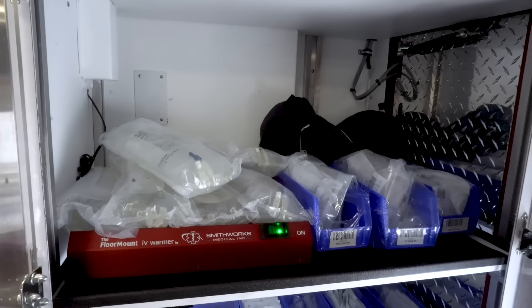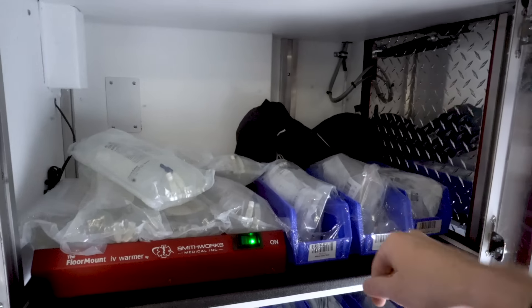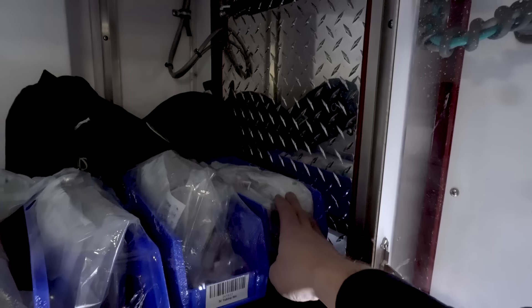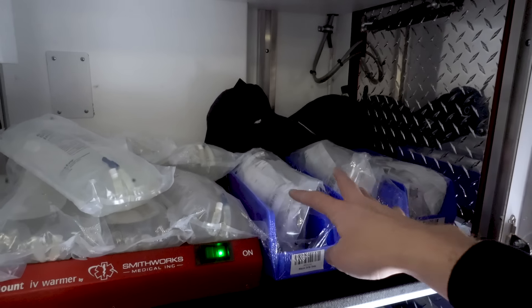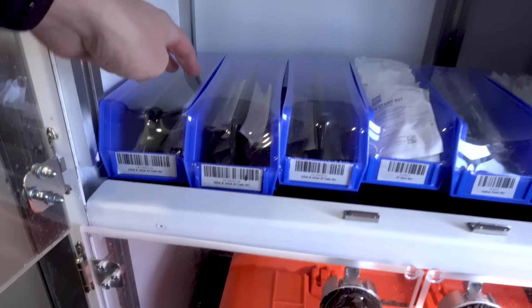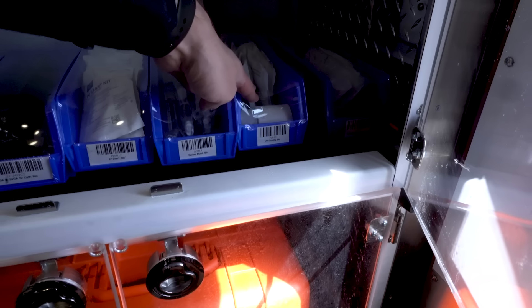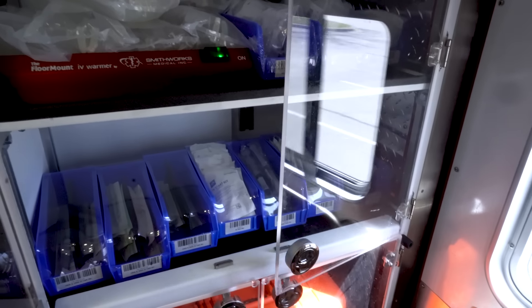Once crews come back to the station at the end of the day, whatever bins are broken or used, they give to the VSTs who switch them out for bins that are already stocked — a pretty quick turnaround and very efficient for the fleet. In here, we've got some patient restraints, spit hoods, and larger leather restraints. We've got IV tubing — both micro drips and macro drips for our infusions. One floor lower, we have all the other IV supplies: needles in 14, 16, 18, 20, 22, and 24 gauge, IV start kits, saline flushes, IV supply bin with tape and tubing, and emesis bags — always important to get to those in a hurry.